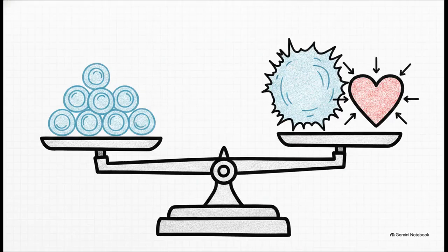Then there's the other half of your oxygenation toolkit, PEEP. Optimizing PEEP is literally popping open collapsed alveoli and recruiting lung tissue, which effectively increases the surface area for gas exchange. But honestly, it's a double-edged sword. Excessive positive pressure can overdistend healthy alveoli, causing barotrauma, and that increased intrathoracic pressure can severely impair venous return, dropping your patient's cardiac output.